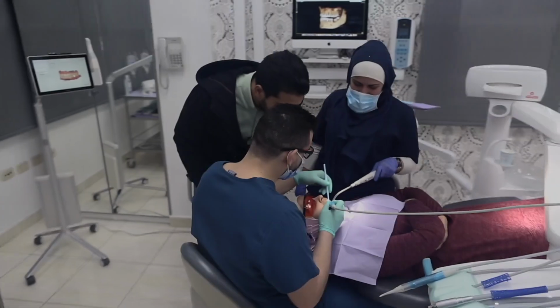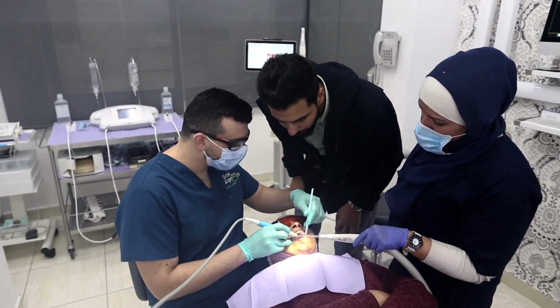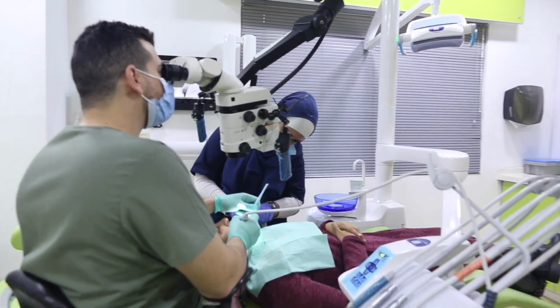And in these upcoming videos, we can see the difference between when we are working with or without the microscope. In this video, we can see how the patient's companion will always ask questions and want to see what you are doing. And you can easily see how it's different when you are working under the microscope.